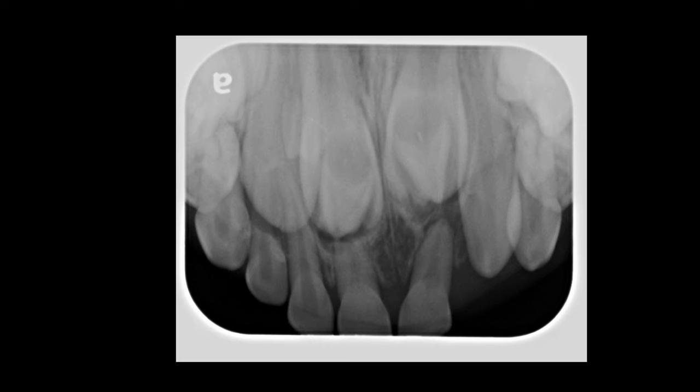Let's take a look at this occlusal radiograph. I want you to spend a few seconds to determine what are primary teeth, what are permanent, how does the eruption status of the right side differ from the left side, how many extra teeth — supernumeraries — do you see? Those are some questions you want to be asking yourself before I run through this radiograph with you, because there's a lot of information captured here and if you're not used to seeing occlusal radiographs this can certainly be very confusing at first.